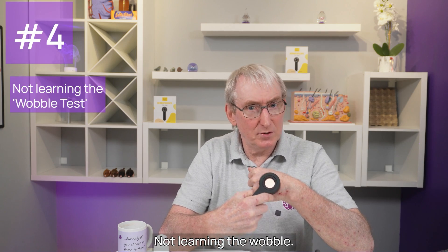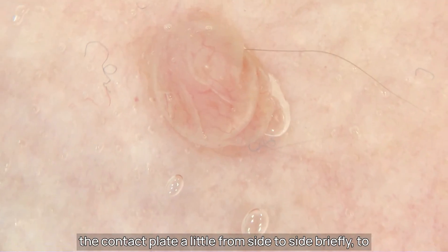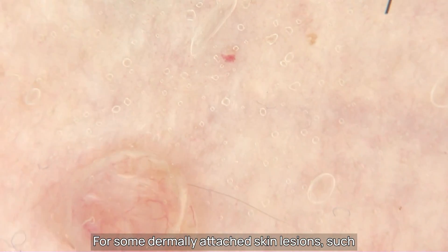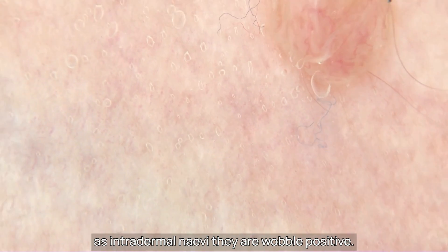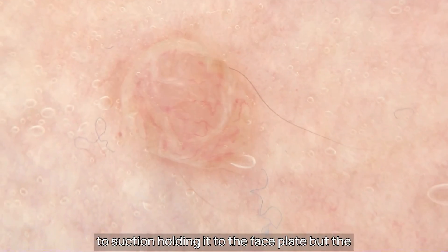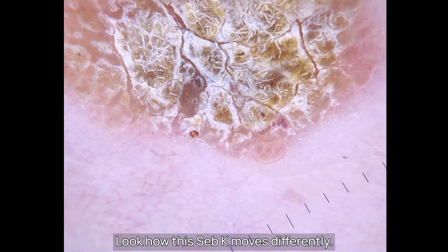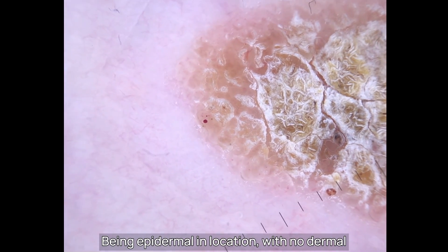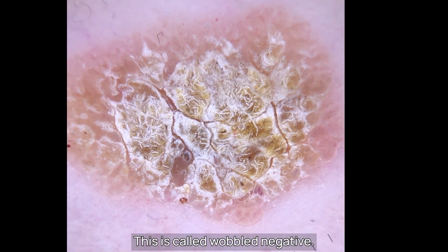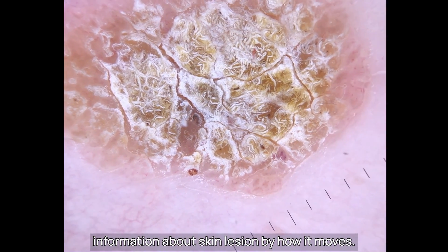Mistake number four: not learning the wobble test. When using contact dermoscopy, learn to move the contact plate a little from side to side briefly to see if the lesion is wobble positive or negative. For some dermally attached skin lesions such as intradermal naevi, they are wobble positive — the tip of the lesion moves back and forth due to suction holding it to the face plate, but the deeper parts being fixed in the dermis don't move. Seb-Ks, being epidermal in location with no dermal roots, stick by suction to the contact plate and can be moved over the dermis — this is called wobble negative. Practice this technique as it gives you extra information about a skin lesion by how it moves.